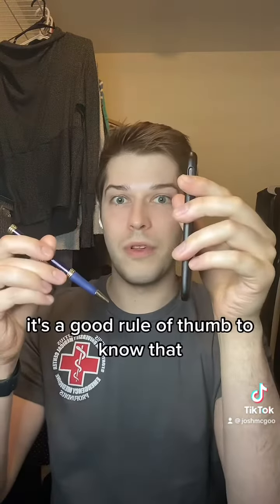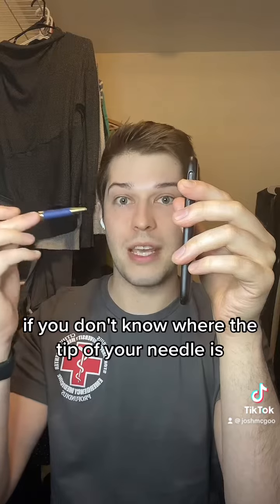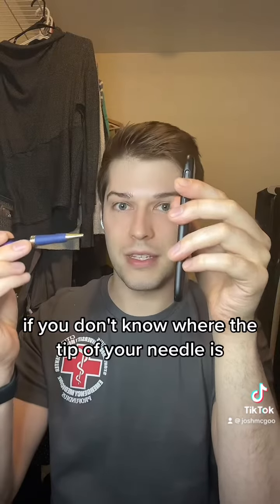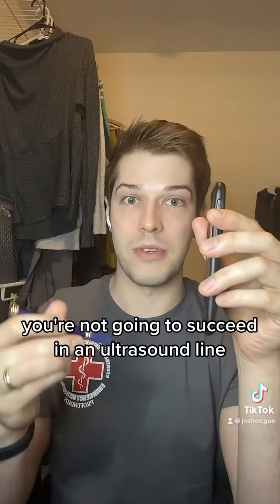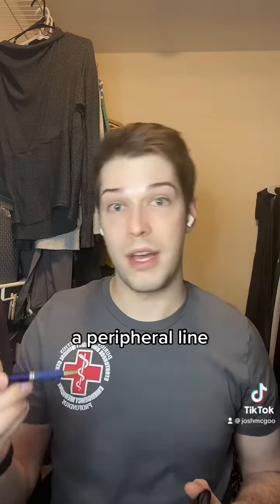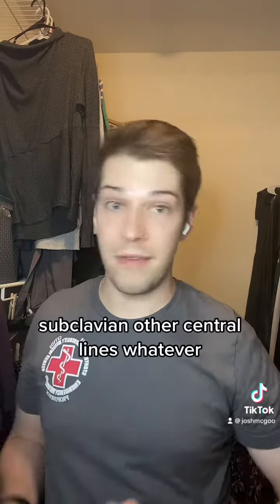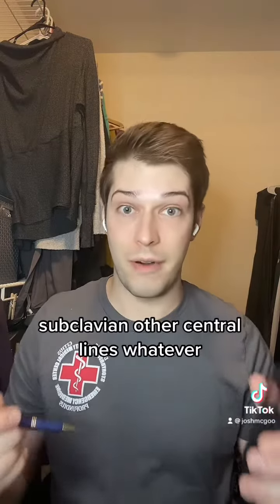It's a good rule of thumb to know that if you don't know where the tip of your needle is, you're not going to succeed in an ultrasound line — whether it's a midline, a peripheral line, subclavian, or other central lines.